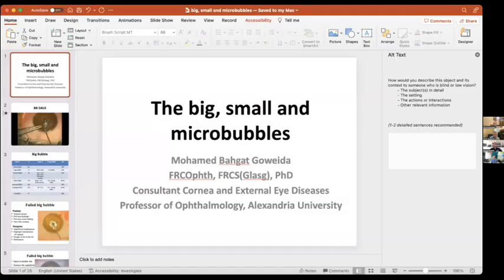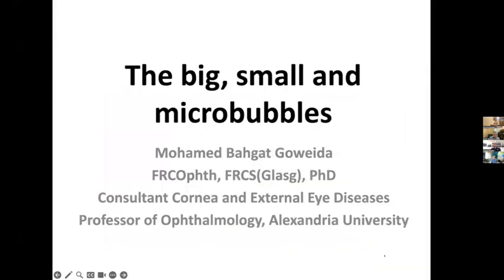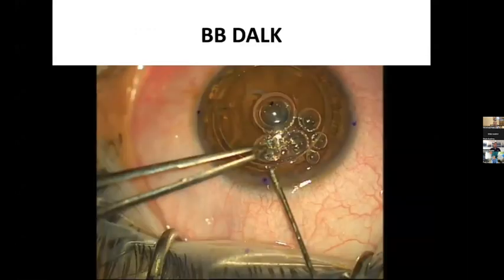Hello, everybody. It's a pleasure to be with you today, and thanks to Professor Mazen and Professor Christopher for inviting me to this session. So now I'm going to go somewhat advanced in the field of the big bubble DALK. Can a big bubble be a small bubble or a micro bubble? I will present first the big bubble technique.